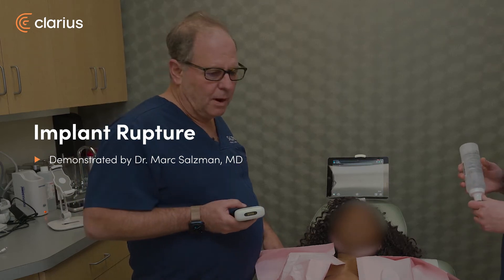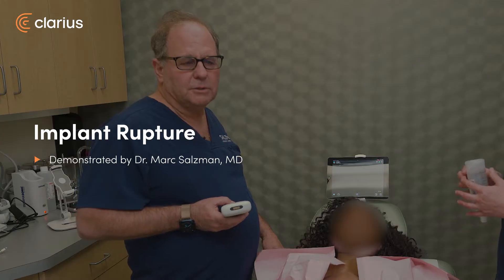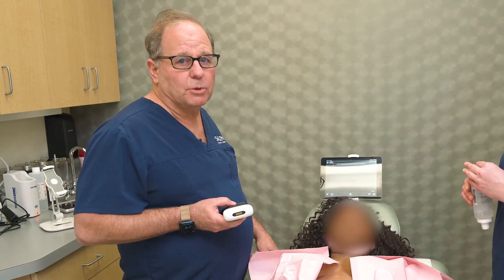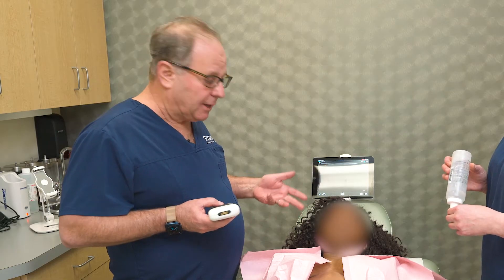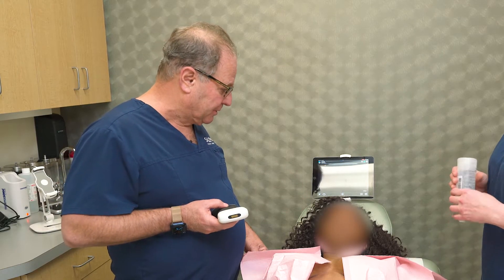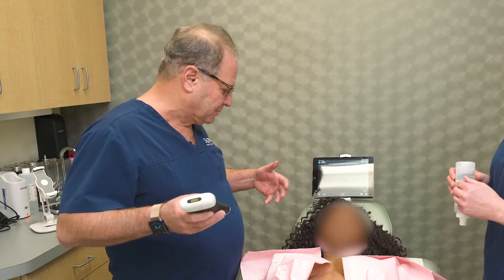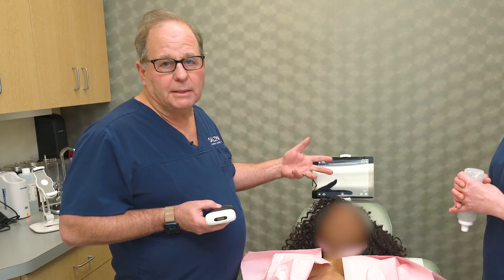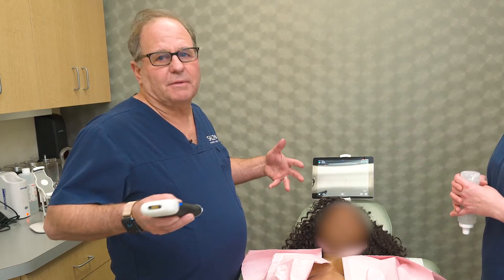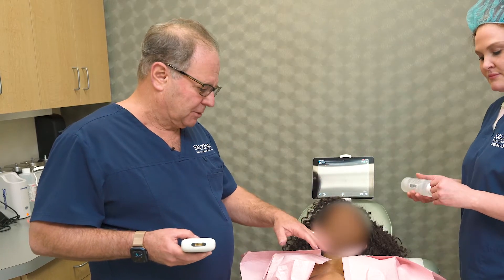This is my patient Kim, who I operated on some 11 years ago. We did a mastopexy with 250cc submuscular Mentor gel implants. Last I saw her was in 2019, right before she moved to Virginia. She wanted a little checkup, we did an ultrasound and everything was fine. She comes in now wanting larger implants and wants to know if everything is still okay, so we're going to examine her today and do an ultrasound.